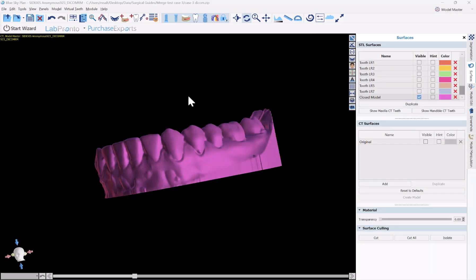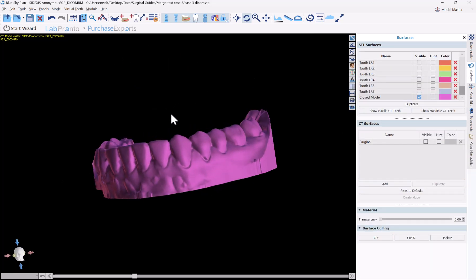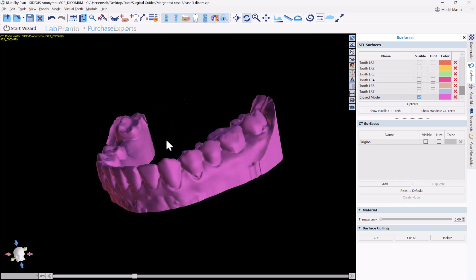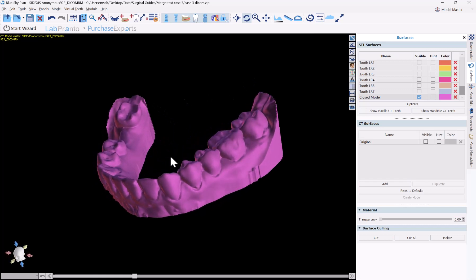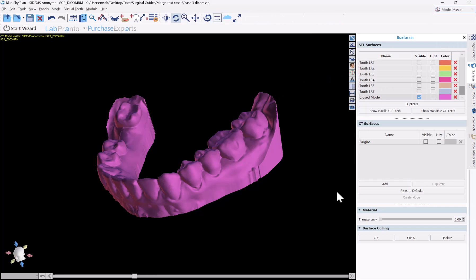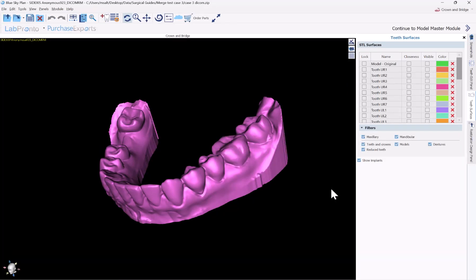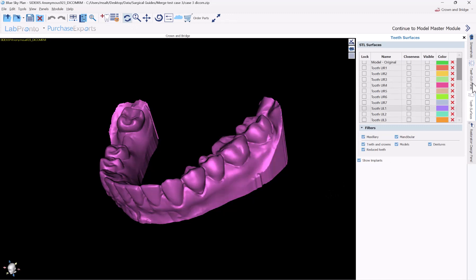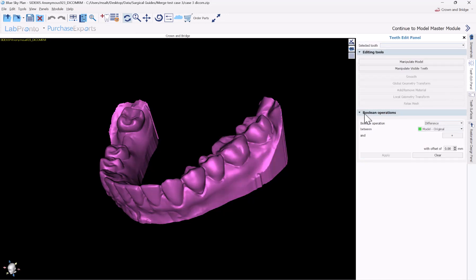The technique that Corey presented is fantastic because it extracts the tooth and leaves us with the actual emergence profile. Go ahead and click on the menu to switch from model to crown and bridge. We're going to be using the boolean functionality found in the crown and bridge module. Then click on the teeth edit panel, and here we can see the boolean operations.